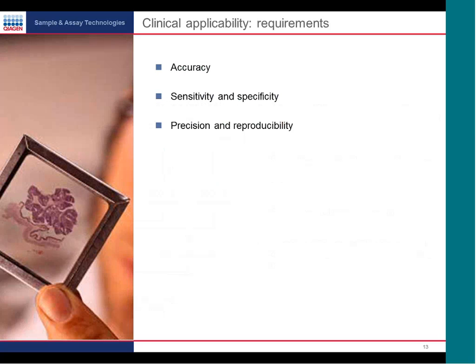Now, to make sure that these gene panels are applicable in a clinical setting, it's very important to do the initial verification. We have to look into the accuracy, sensitivity and specificity, precision, and reproducibility. And we have done these for all the 14 panels we have. Ideally, you should do all these things with each and every panel. But since we are dealing with 14 different panels, I'm going to show you a few representative examples of different panels.